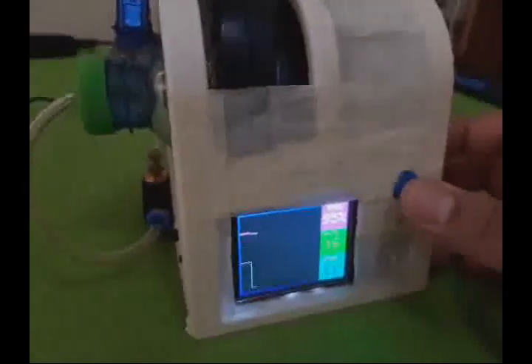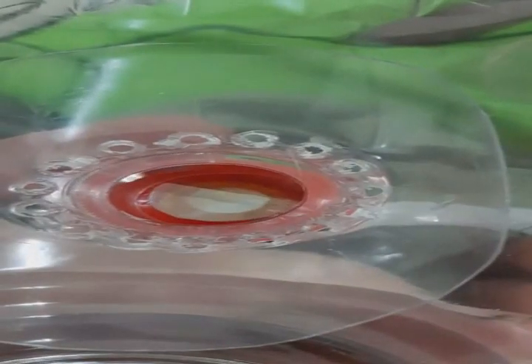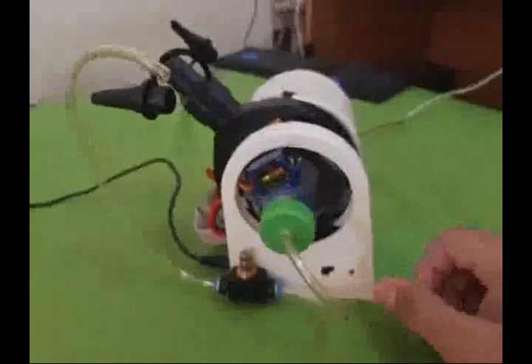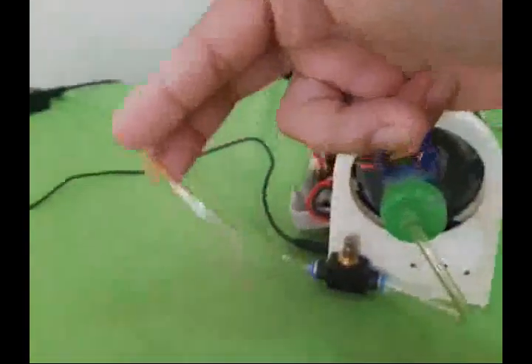And this is the PEEP level, so PEEP mode. When I set the CPAP mode, I double press this button, and now the machine is in CPAP mode. You can see the blower is continuing on, and my servo rotational valve is also open constantly. So that way this is constant pressure. Now in PEEP mode, you will see 0, and it goes again to 20, and again to 0. And this is the oxygen inlet hose I connected here. You can connect this directly to an oxygen cylinder.